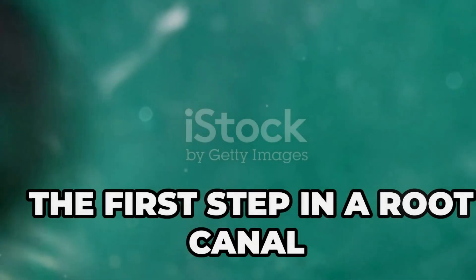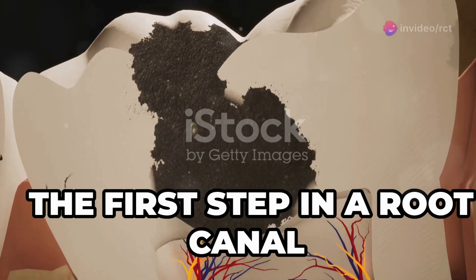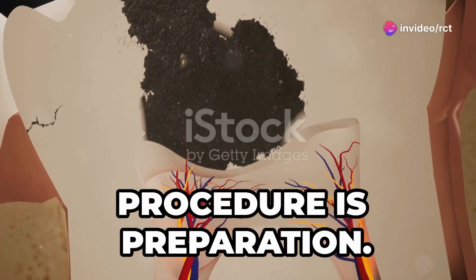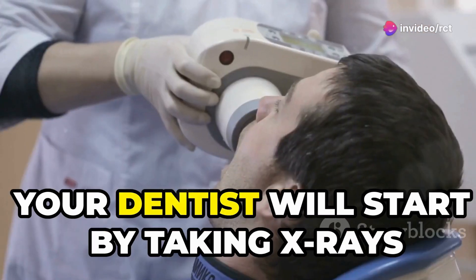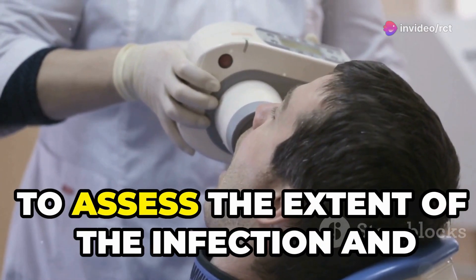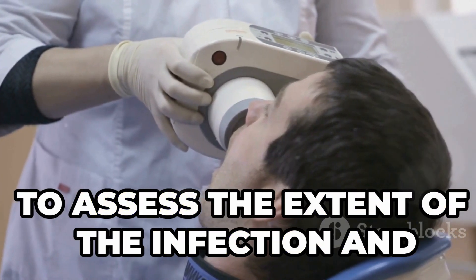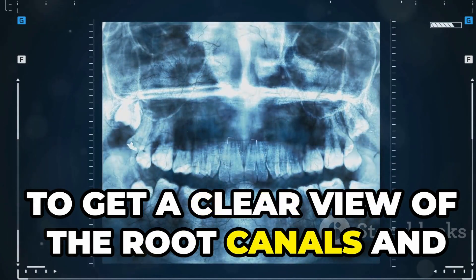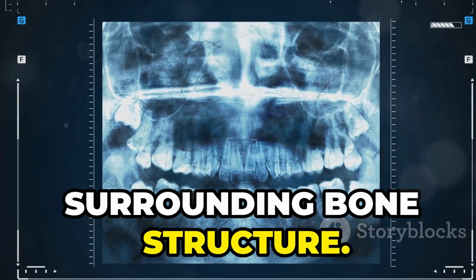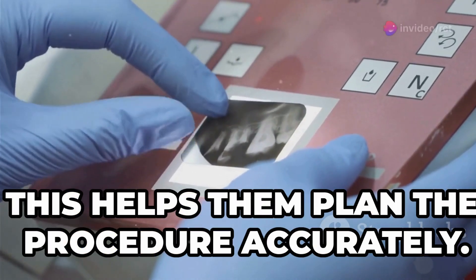The first step in a root canal procedure is preparation. Your dentist will start by taking x-rays to assess the extent of the infection and to get a clear view of the root canals and surrounding bone structure. This helps them plan the procedure accurately.